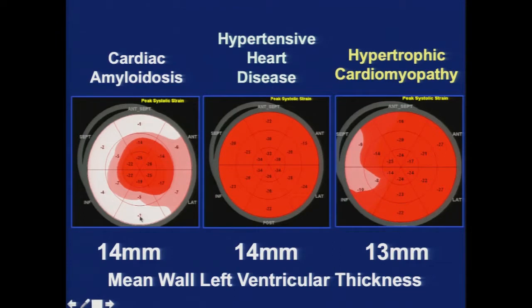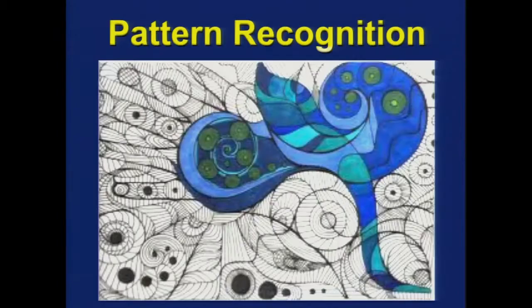And in the amyloid patients, and I think this is a very likely bullseye that you're going to see on the examinations, and I'll show it to you again and again throughout this course when we talk again tomorrow. But you see in the amyloid patients that the apical strains seem to be well preserved, but the basal strains are depressed. This has been commented on as a cherry on top kind of image for the bullseye. And so what we may be looking at are these concepts of pattern recognition, looking at changes in myocardial motion that help us to discern what may be the mechanism for the ventricular dysfunction.